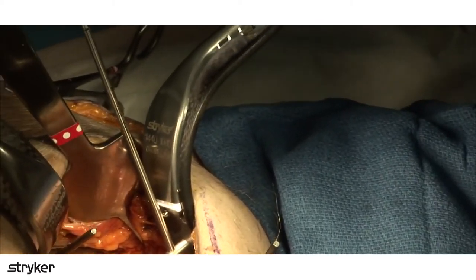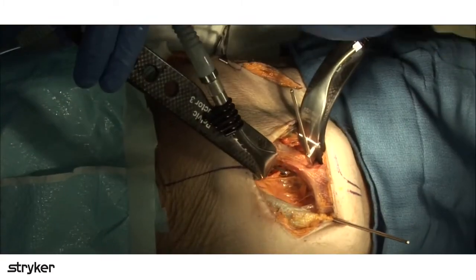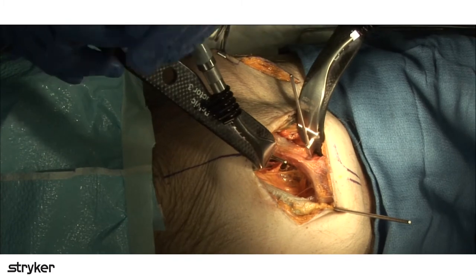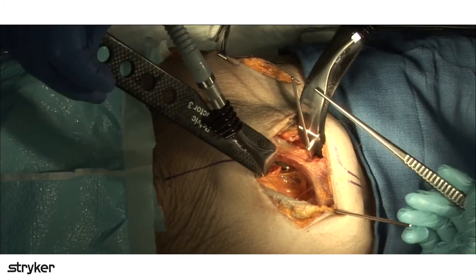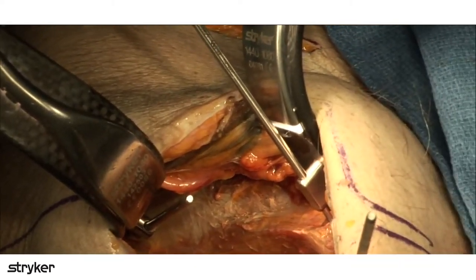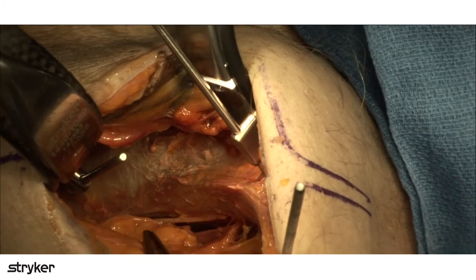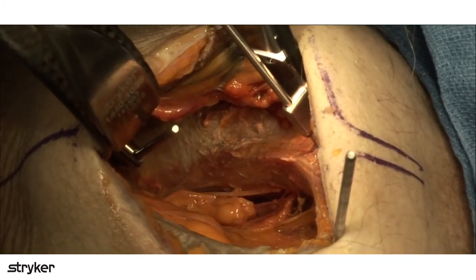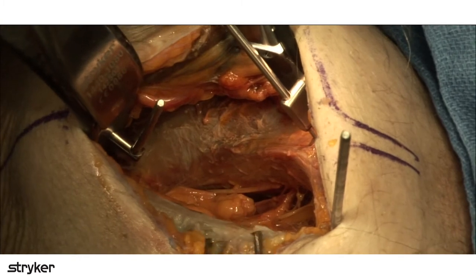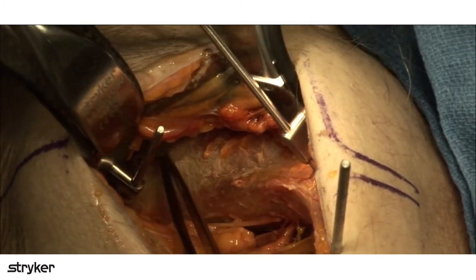Good. We can probably take that one out. The one advantage to these retractors is that they have fiber optic lights that you can hook up to them, so you can really, there you go, that's a pretty nice view right there. So you can really help to improve the lighting inside the wound. That's the first half, or part A, of this whole dissection: getting into the internal iliac fossa.